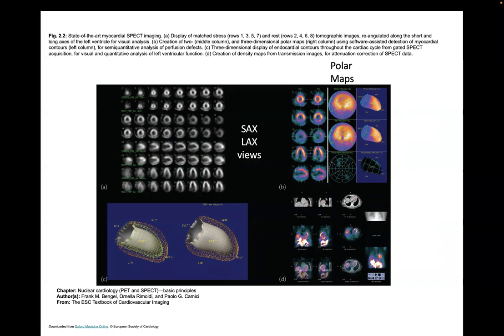The bad news about it is, because there's a lot of leeway, you're going to get high variability in reads depending on who's reading it. The good news about that is, if you are the cardiologist, it gives you a lot of freedom to keep pushing the patient through a diagnostic protocol or stopping and saying, oh, you're fine. That sounds kind of ironic. You say, well, why, do you really want to give a physician that much freedom? Because the data is noisy. And sometimes you do. Sometimes, having a good cardiologist who knows all of the other clinical data and everything, it's good to give them a lot of freedom. Because if they're experienced, humans are a really good sort of deep learning network.